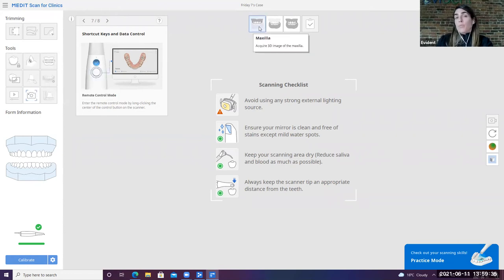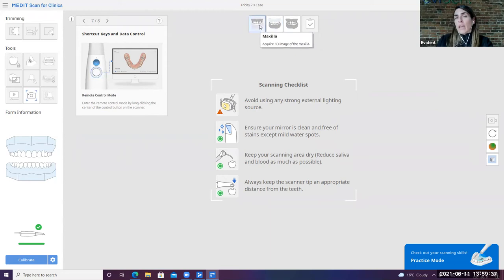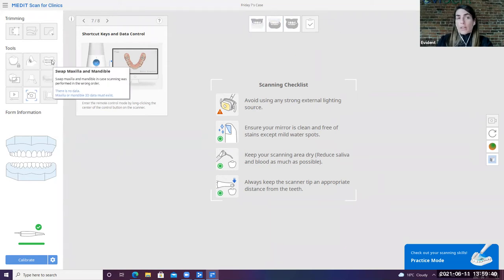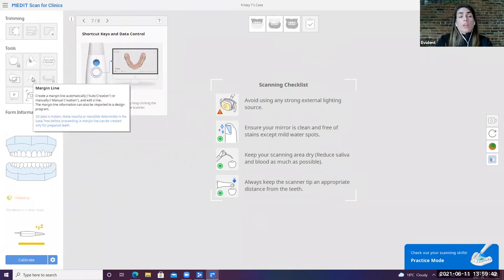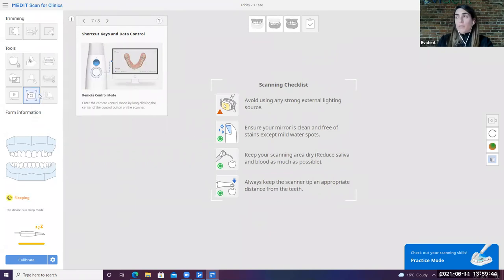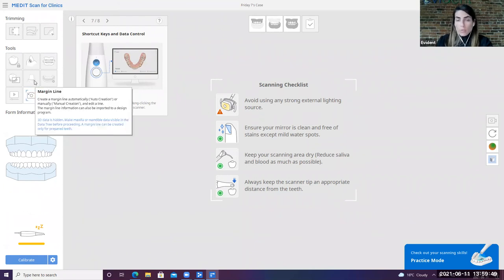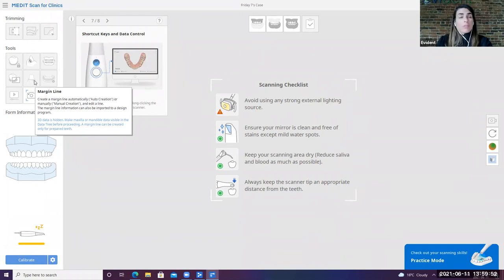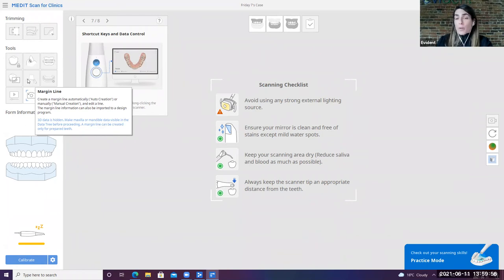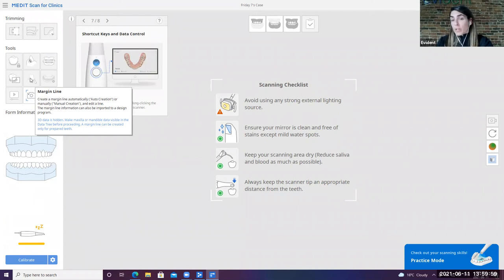Say, for example, in the workflow up here, you've scanned your lower before your upper. No worries. You can go ahead and swap those arches. You can also mark your margins. Say, for example, if you've got a really tricky crown and bridge case, patient's a bit of a bleeder. You've done the best that you can to control everything, and that margin just isn't super clear. Perhaps it's going to be a feather edge, deep furcation. You have the option to mark that margin for your lab in order for them to be able to see that information a little bit more clearly.